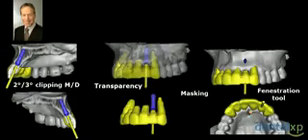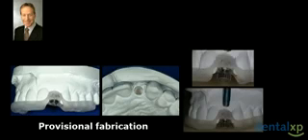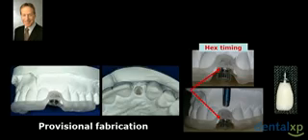And yes, we think that there might be the potential for a dehiscence, but in a flapless approach and not disrupting the periosteum, that really becomes a non-issue. It becomes a non-issue proactively, not reactively. And so we can now take our surgical guide, we can go to the laboratory, we can fabricate a precision provisional restoration, all done in the lab, setting the analog, developing the provisional restoration with proper hex timing, and set up the provisional.